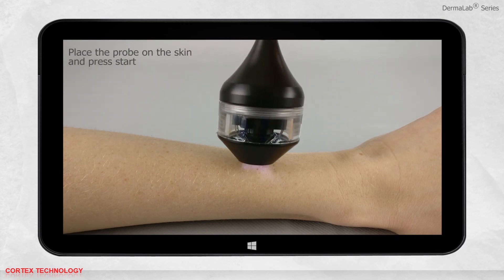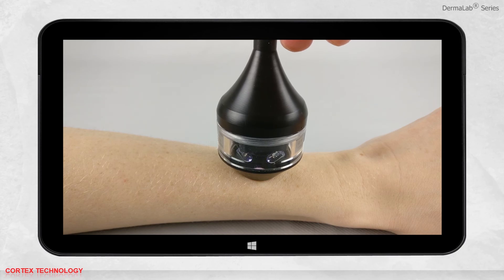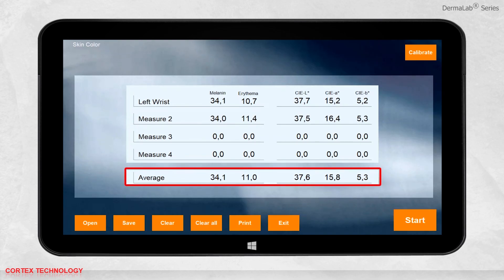Place the probe on the skin and press start to perform the skin color measurement. After making a measurement, the results will be shown in the interface. The measurement is presented in erythema and melanin index, as well as CIE lab color space. You can change the name of the measurement. When you take multiple measurements, the average of each value will be calculated.